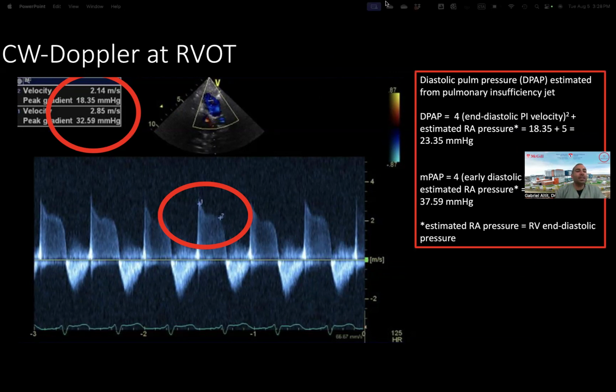So typically, the curve of an aortic or pulmonary insufficiency is a curve in diastole where you get an early phase of diastole, which typically you'll get a higher acceleration because your RV and your LV in general will be sucking up all the blood. It's empty. So that's the lowest pressure during diastole in your LV or your RV.